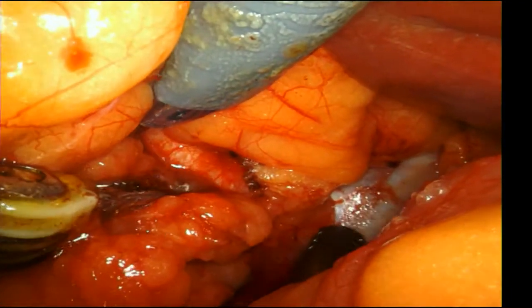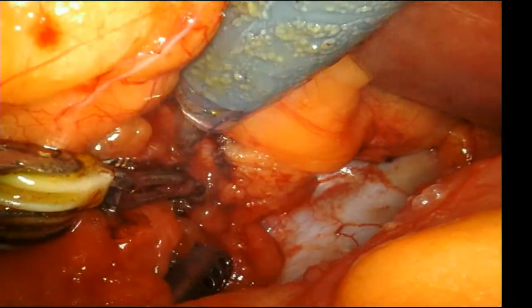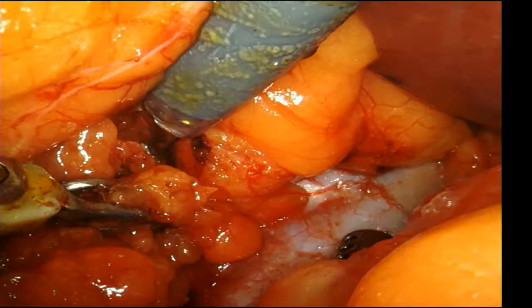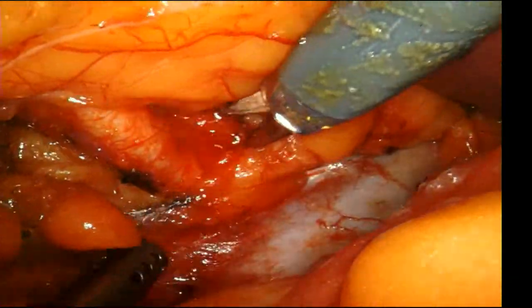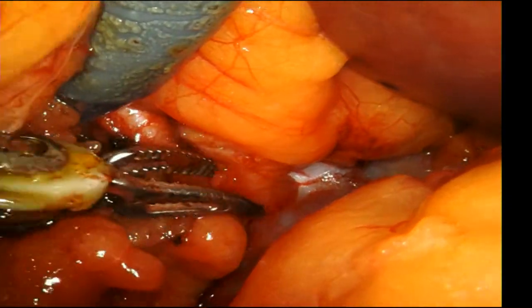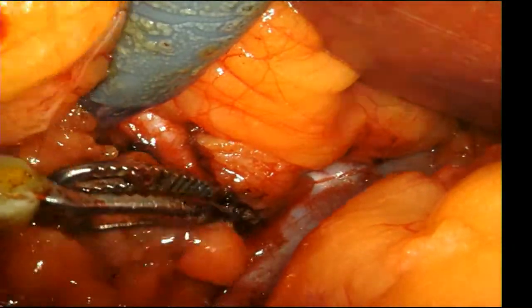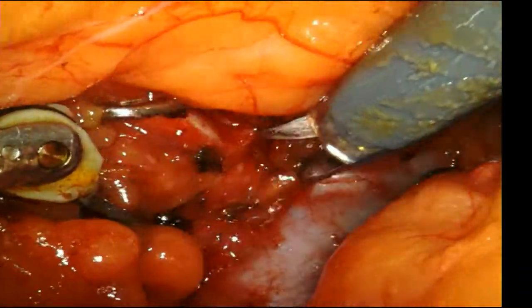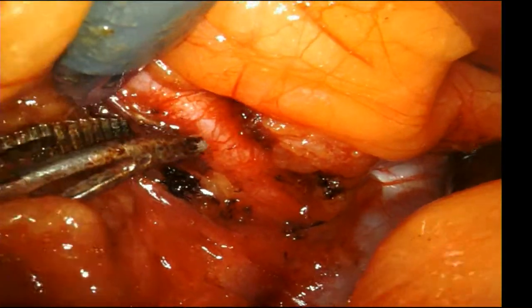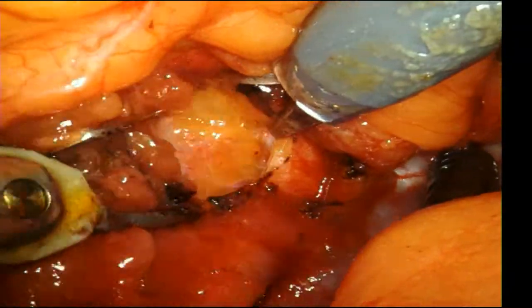Now, Ronnie, your assistant is once again an air seal port, right, with the pneumoperitoneum also at 6? No, we're using normal pneumo pressure here. We tend to use more normal pressures on these kidney cases because the bowel doesn't fall away as well as it does on pelvic cases where gravity does the retracting. So we tend to use 12 or 15 on the kidneys, but sometimes we'll turn them down if we can. Especially if we're doing a ureteral reconstruction case, we'll purposely turn it down so that we're not making the gap between the healthy ends of the ureter longer than it needs to be.